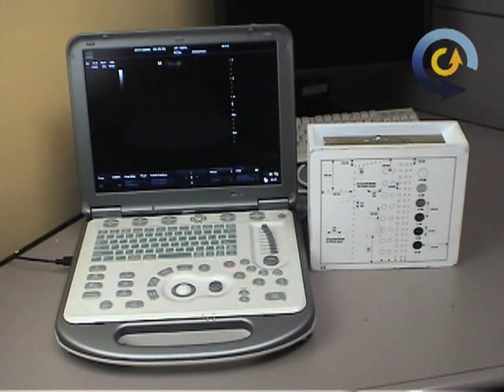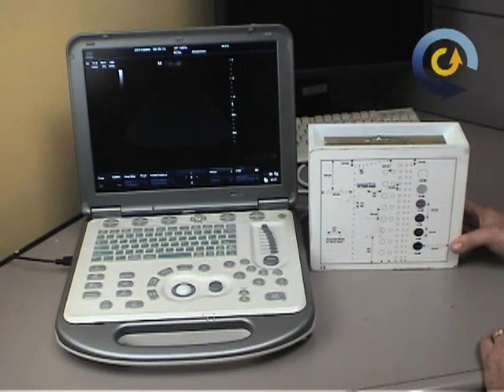The phantom is used primarily for QA and assisting in troubleshooting with the ultrasound image or a probe issue. It provides constant and reproducible images of known targets and distances, and it allows you to document the system performance over time. The phantom itself physically is made up of a variety of items.